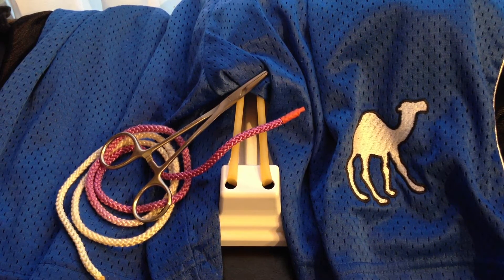Hello, this is Dr. Amidari, and today I'm going to be teaching you how to tie the instrument tie with your left hand.